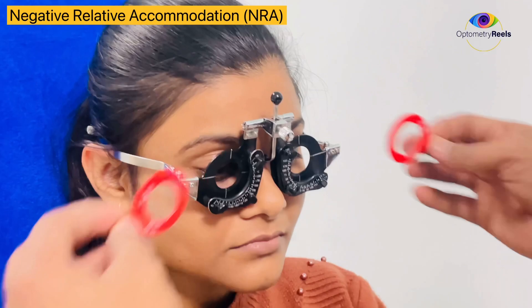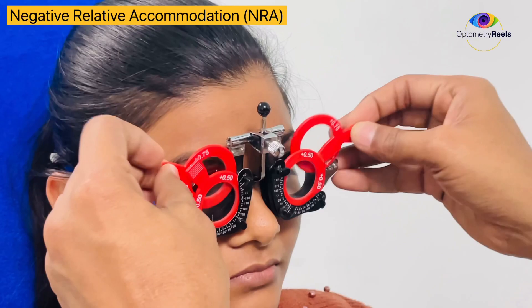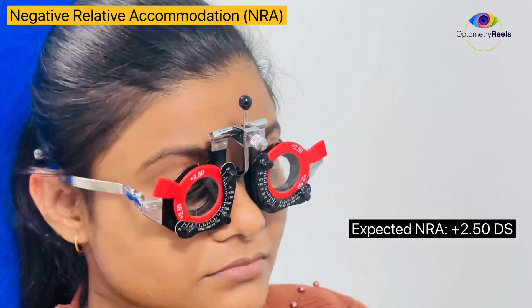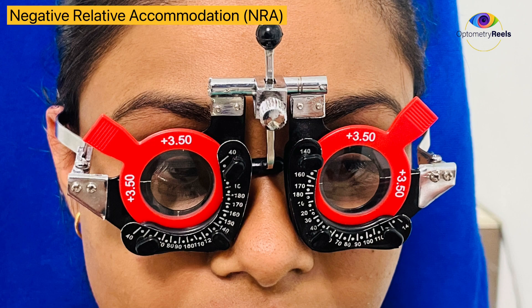Let me know when you are not able to make it clear — when you achieve a sustained blur. This NRA test is performed using plus lenses. We have to gradually increase the power of the lens until the patient reports sustained blur. Also make sure that you are placing the next lens before removing the previous lens.